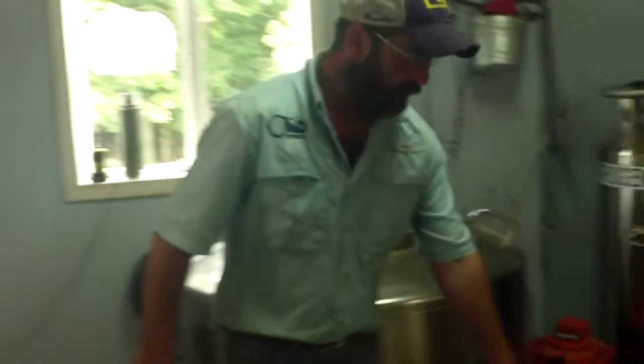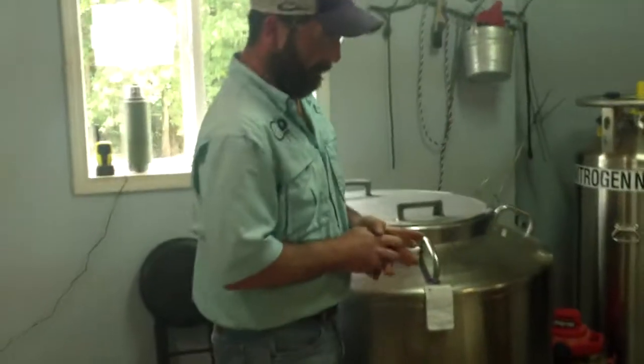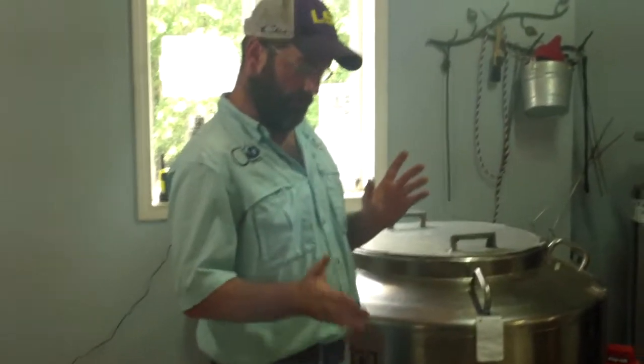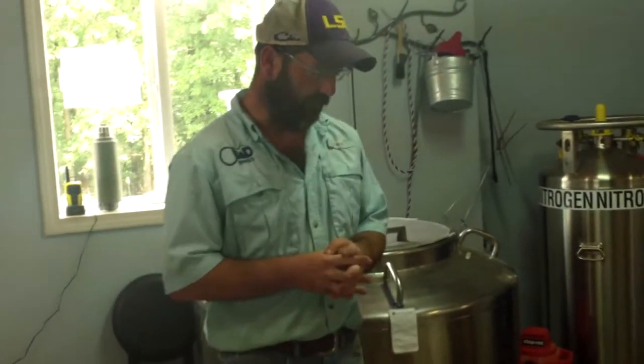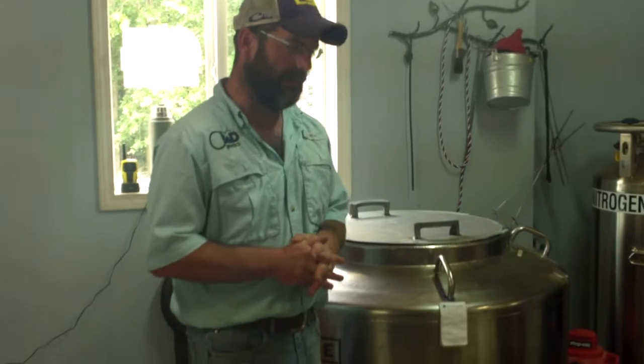One of the main questions we get is: how long will the semen last in the tank? As long as you keep the tank cold to where it's supposed to be and the samples stay frozen, they can remain indefinitely. That was part of my master's project — we looked at cow semen that was frozen between 1950 and 1960 and kept frozen up until 2008 to 2010. We saw no difference in pregnancy rates and no difference in post-thaw evaluations.